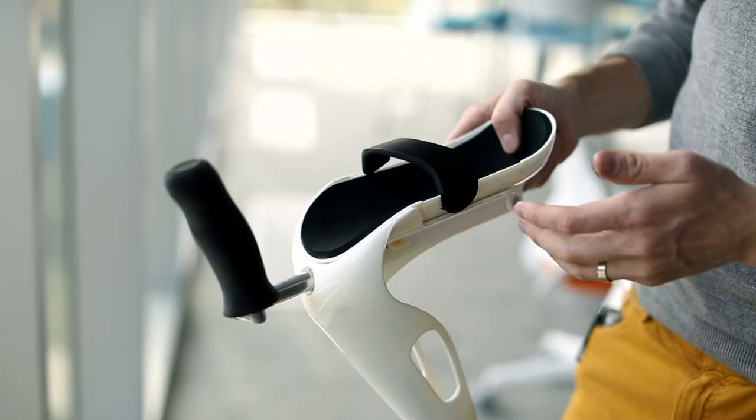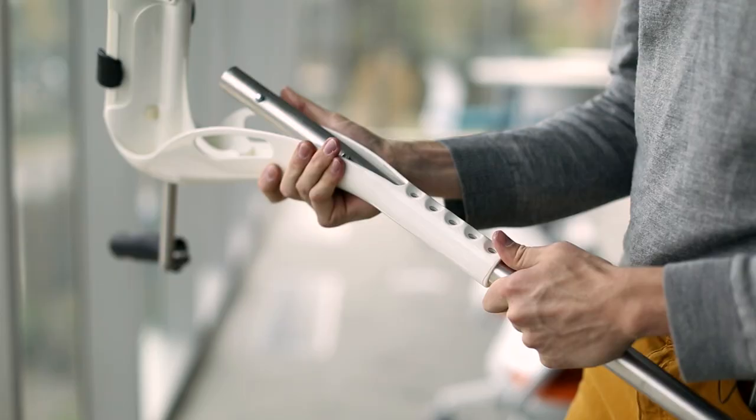We've designed a pain free alternative to the typical crutch that you're used to seeing. The main body is designed to cradle the elbow and support the user's weight while absorbing the impact of each step.